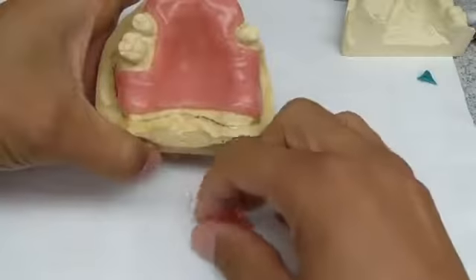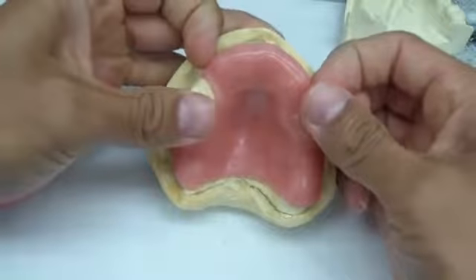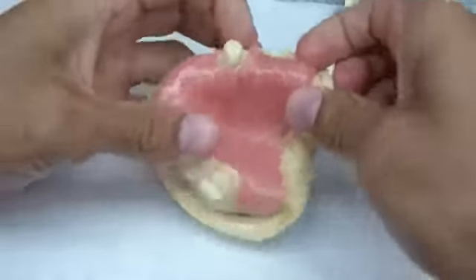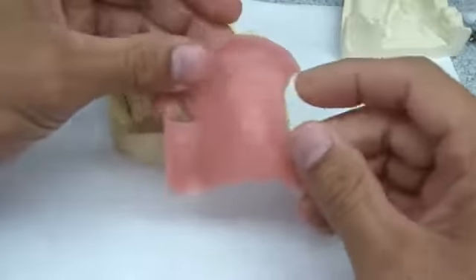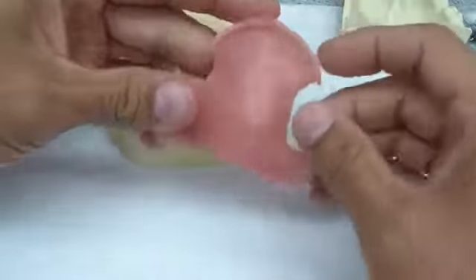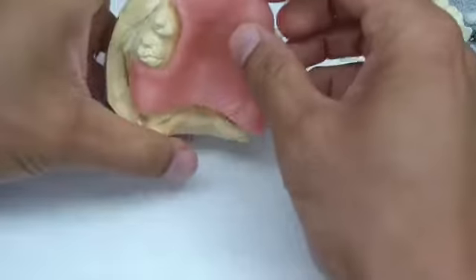Okay, so here now is the record base, the denture base, cured out of the light curing oven. Here to remove it. There we go. So the Vaseline worked. And now what I'm going to do is just take a football bur on a slow speed and just round everything off. And the next stage is to place some wax in strategic spots.